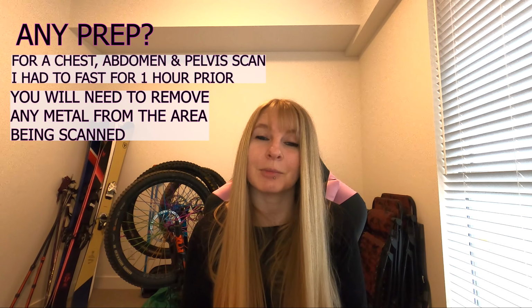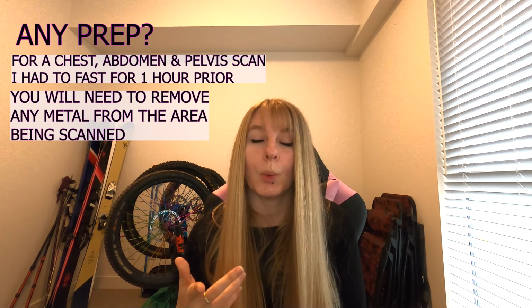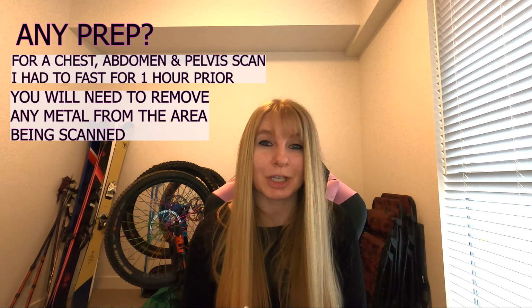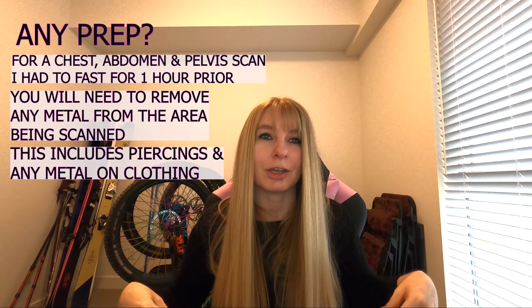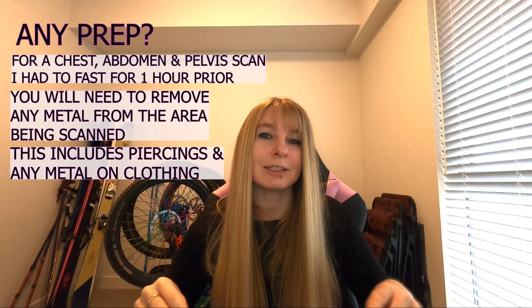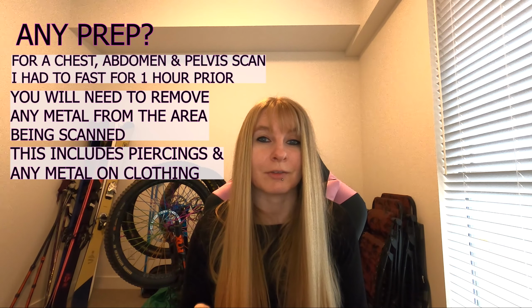For the scan I recently had on my chest, abdomen and pelvis, obviously my piercings and everything up here could stay in because my head was never in the scanner. What I had to do though, because I'd worn jeans, was just put a gown or a blanket over my midsection and then just pull the jeans down to my knees so that the zipper and the button were out of sight of the scan.